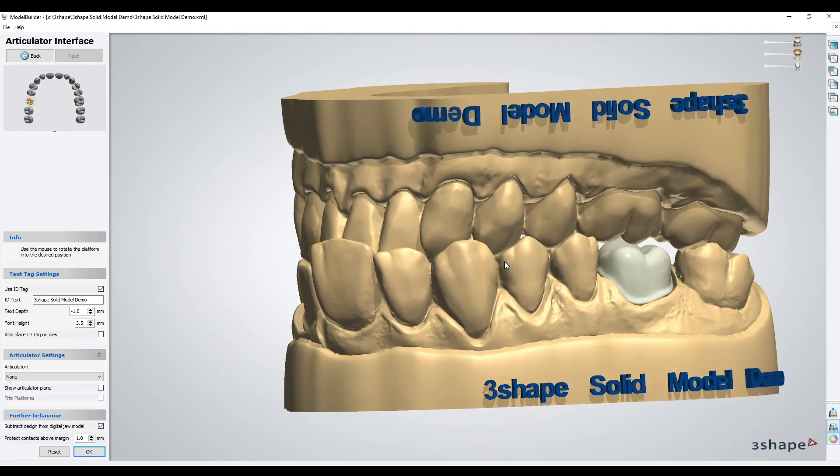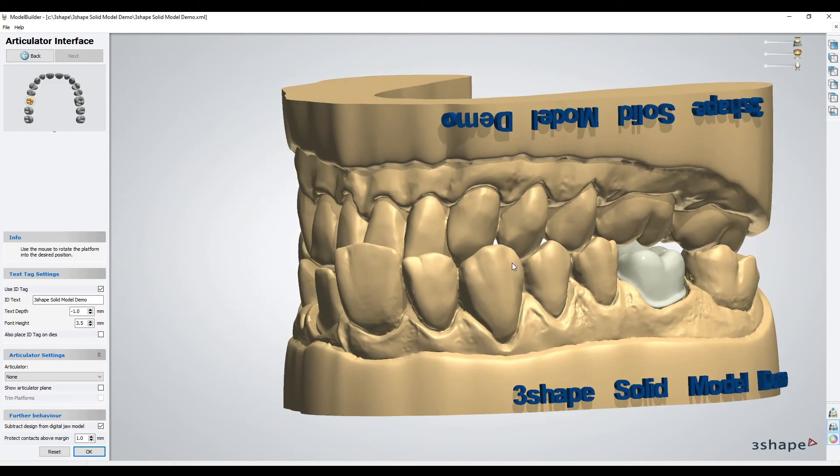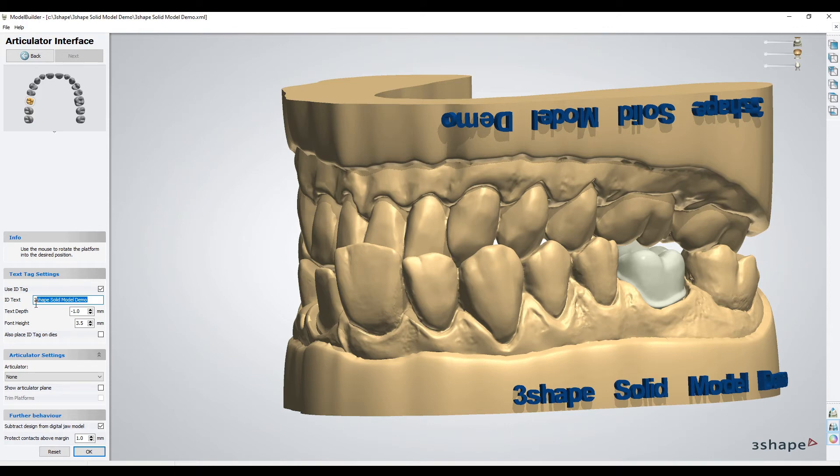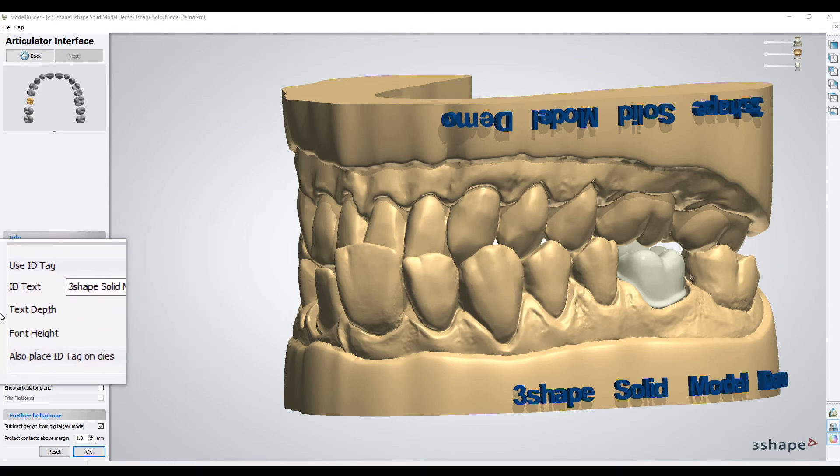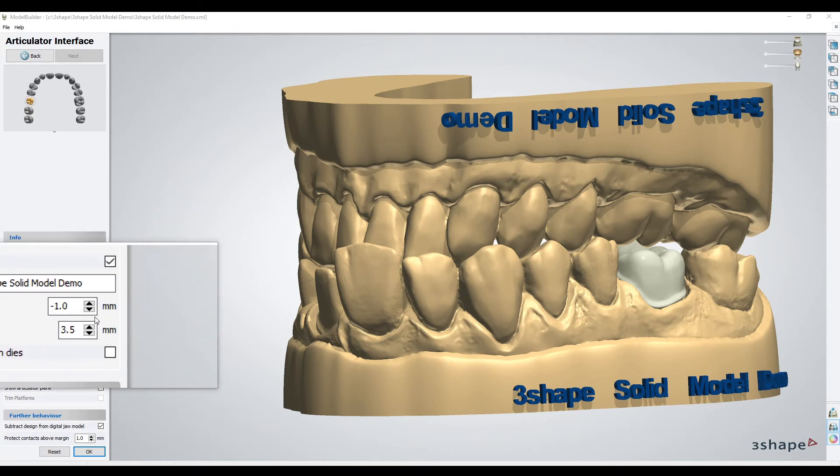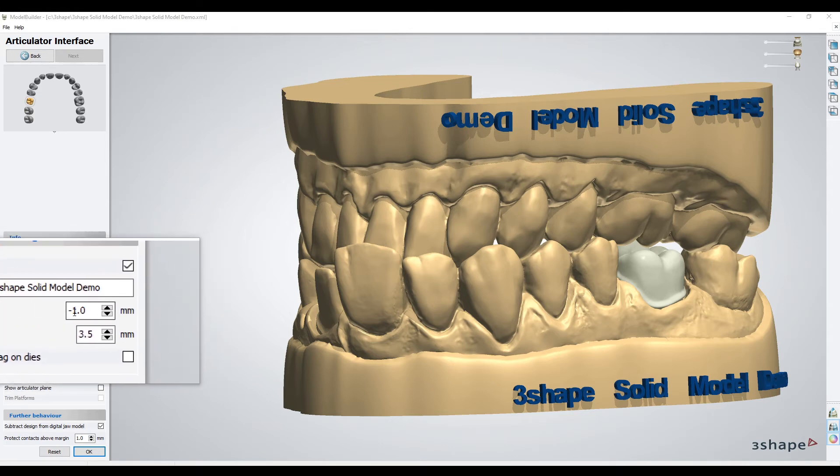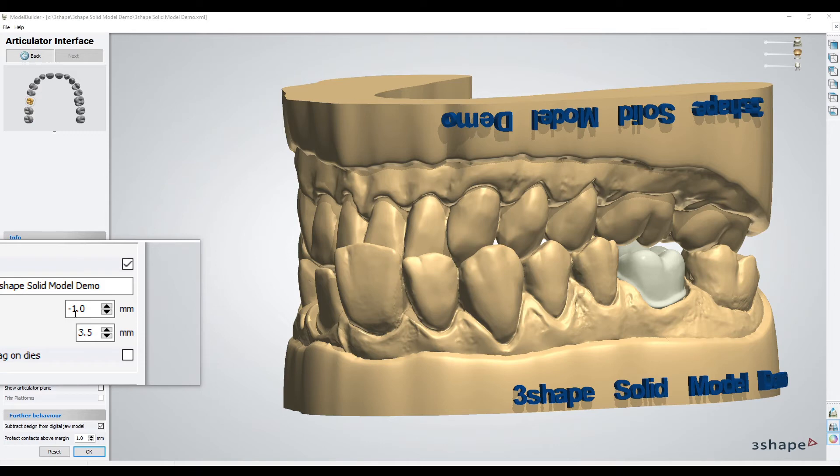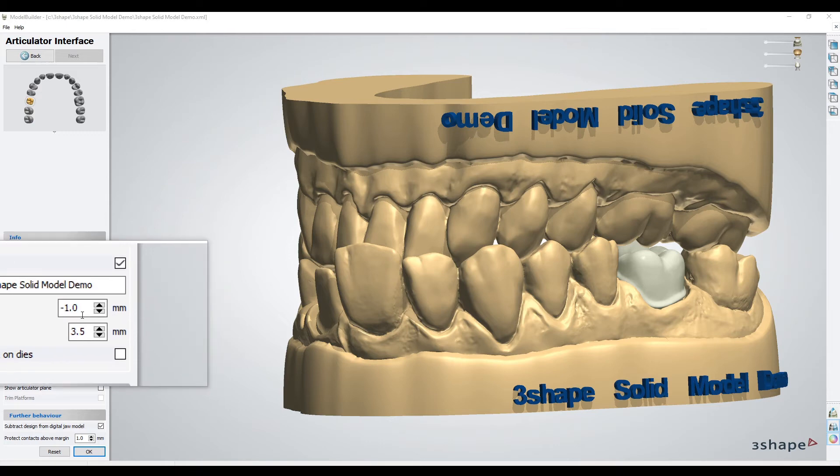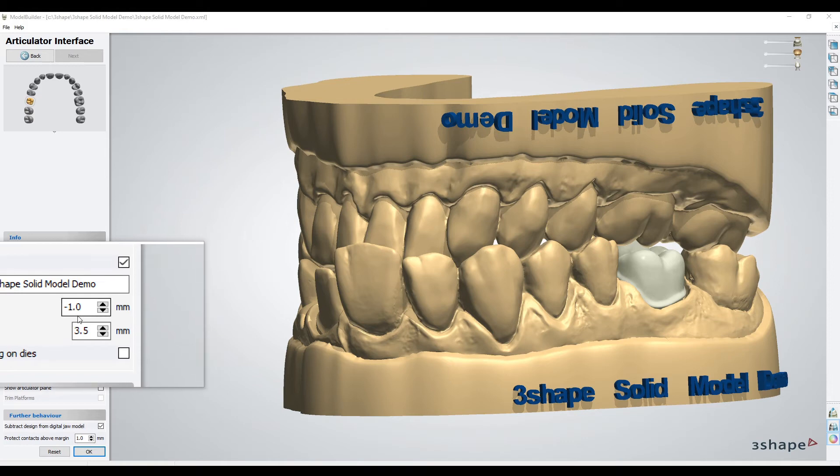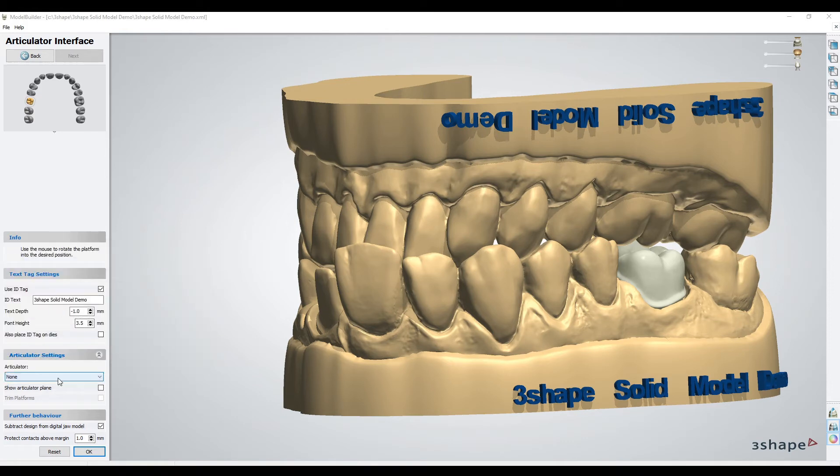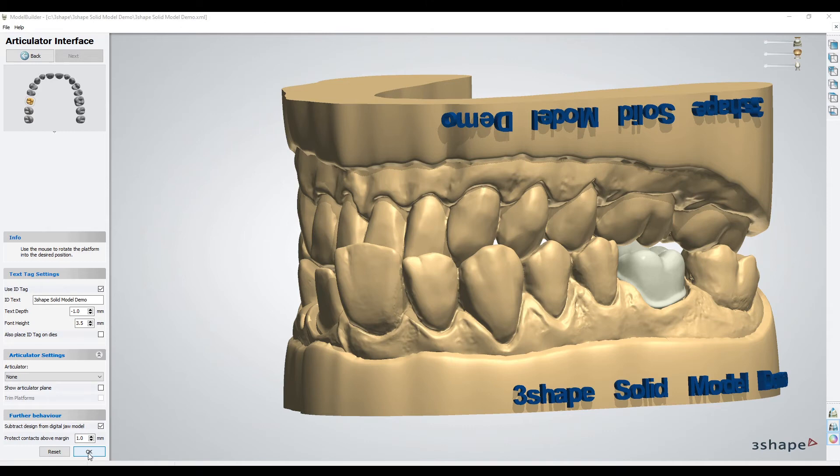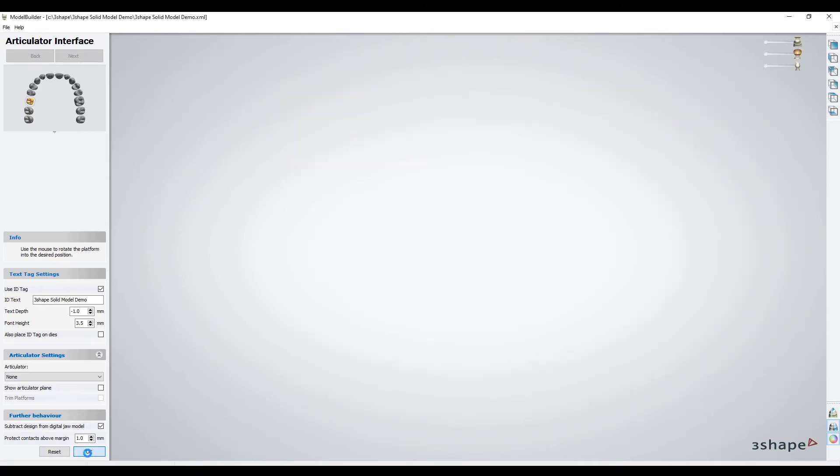The second to last step here is the articulator interface. This is where you can change or add ID text to the model. I highly recommend changing the text depth to negative. I do not like positive texts—they typically don't come out that great. A negative puts the text into the model. This is also the stage where you can add an articulator. I won't get into that here, but you can have an articulator on the back.